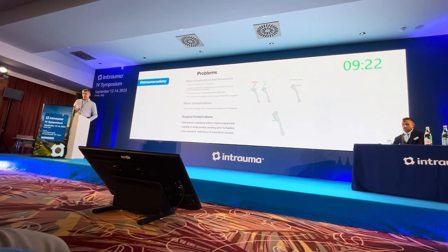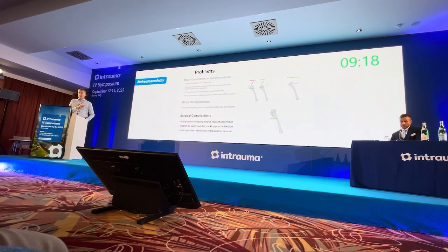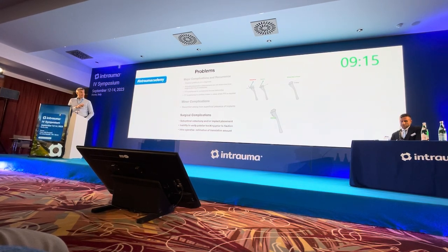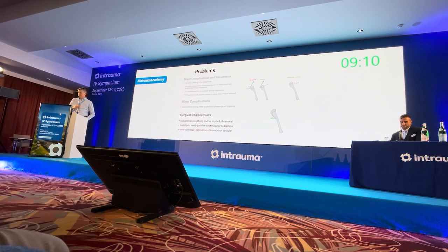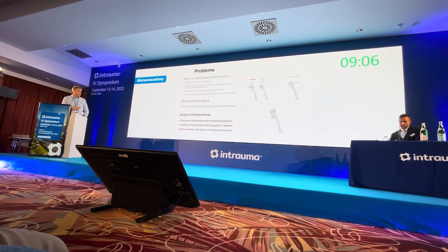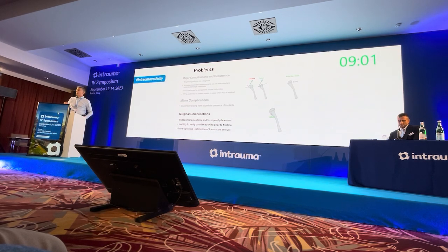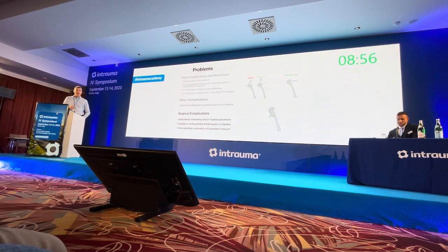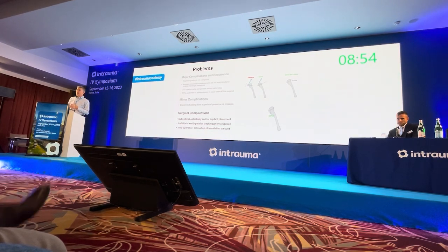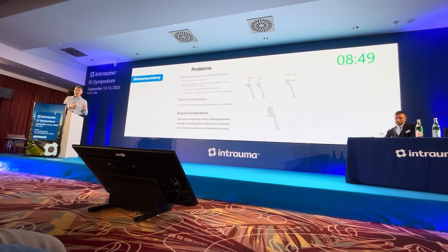Tibial tuberosity avulsion is reported to be much higher in cases with one pin rather than two pins, and it's been demonstrated that the addition of a cerclage wire as a tibial tension band wire decreases the risk of avulsion. The traditional TTT technique also does not allow the surgeon to verify patellar tracking prior to final fixation. And to date, there hasn't been a method to accurately measure and estimate the amount of translation required for this technique.